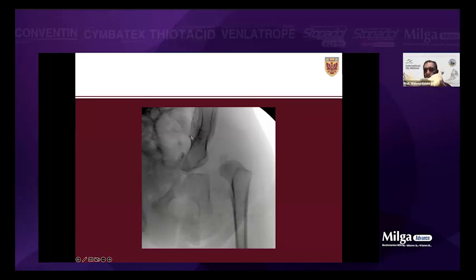I have a pelvis model just to show you the iliac crest is curving. So every time you're going posterior, there's a curvature. So keep feeling it before you cut. Otherwise, you'll fall into the abdomen or you fall lateral. Then once you go into the muscles, it will bleed, especially with a knife.